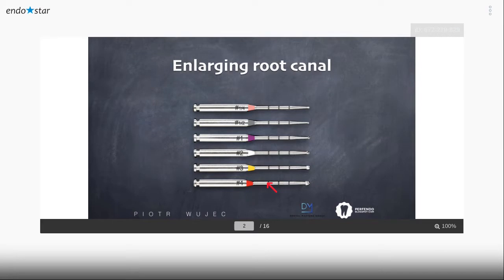You showed the rotary files from MetaBiomed that can create a space above the canal, and they are great instruments. But when the canal is straight and we need to quickly enlarge the canal space above the broken instrument, we can use Moon's Discovery burrs.